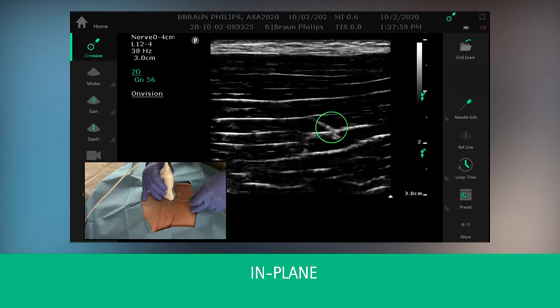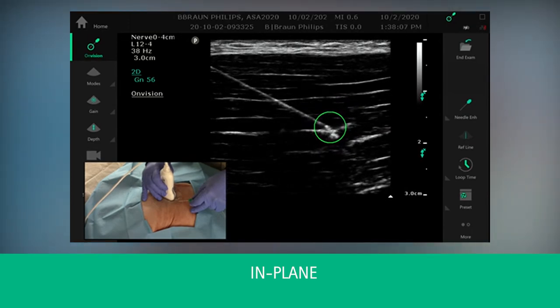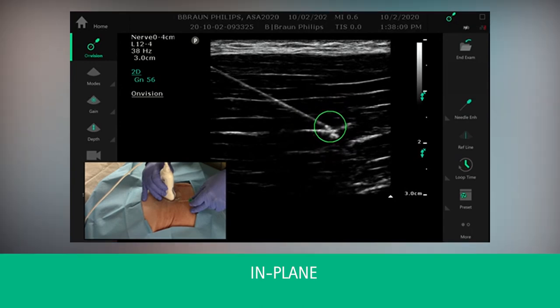Once the needle tip is under the ultrasound plane, you can rotate and get alignment with the ultrasound plane and the needle shaft.